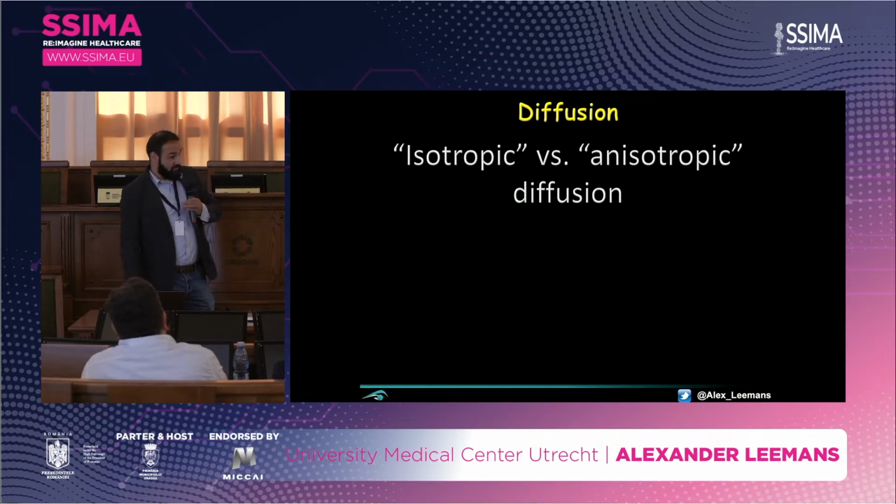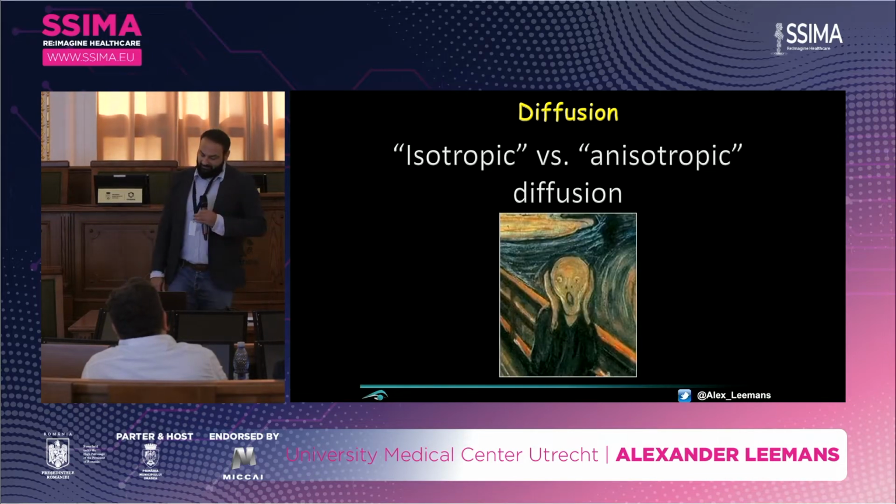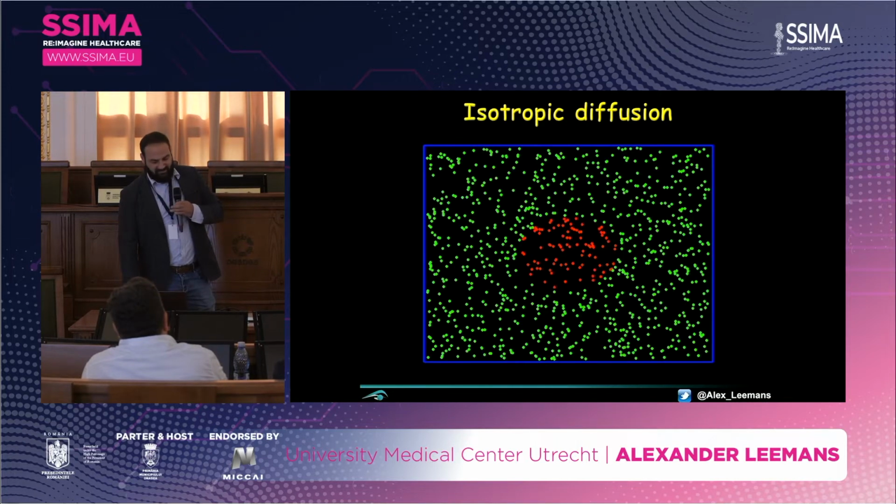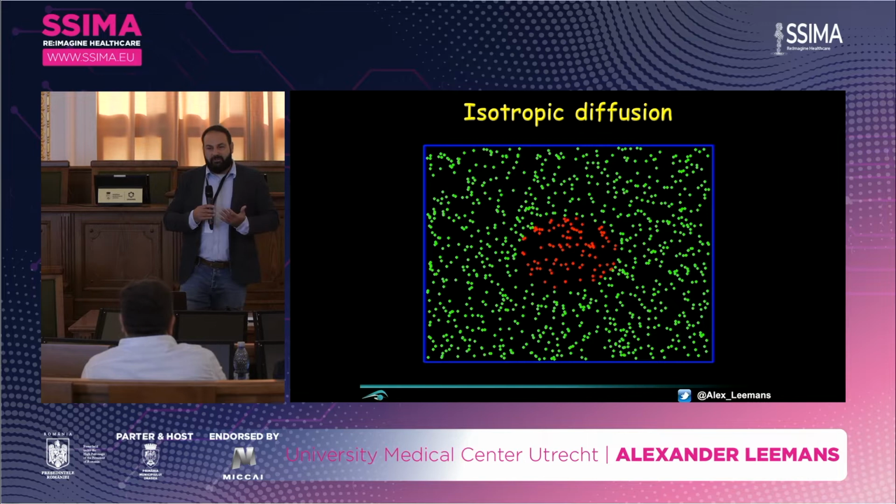An important concept that I want you to understand about diffusion is the difference between isotropic and anisotropic diffusion. That's the typical reaction most students get when they hear about anisotropic diffusion. Sounds very difficult, but it's just fancy to say something about the type of diffusion.